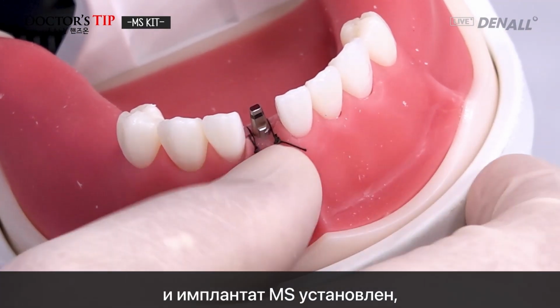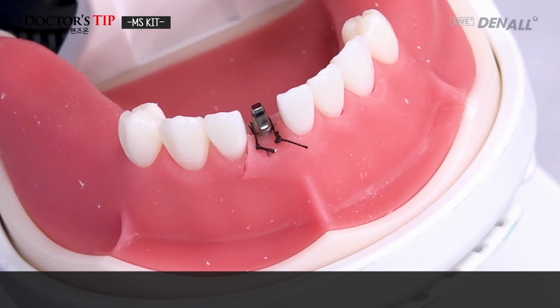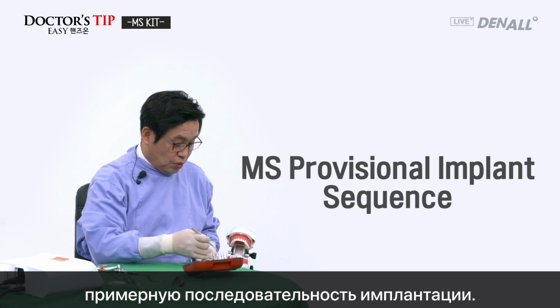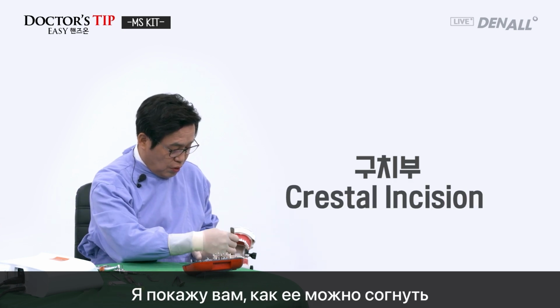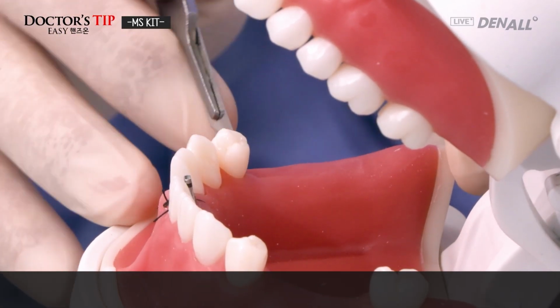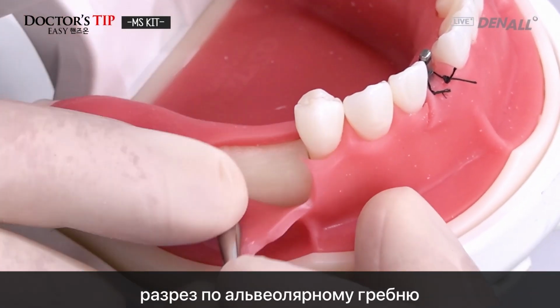Like this, and the MS implant is placed, and now you can create the provisional restoration. Next, let's see the provisional implant sequence, and I'll show you how it can be bent. So I'll put one in the molar area, crestal incision, and then the flap is elevated.